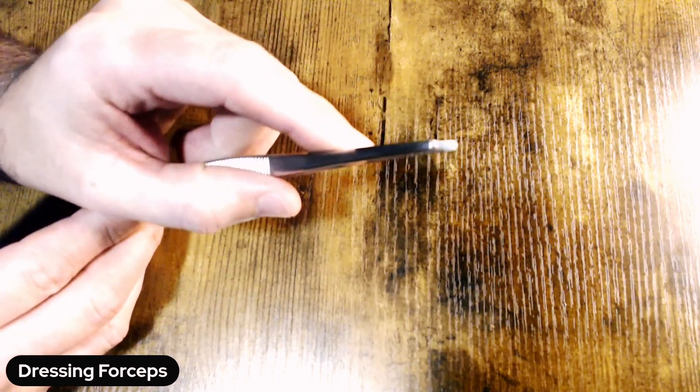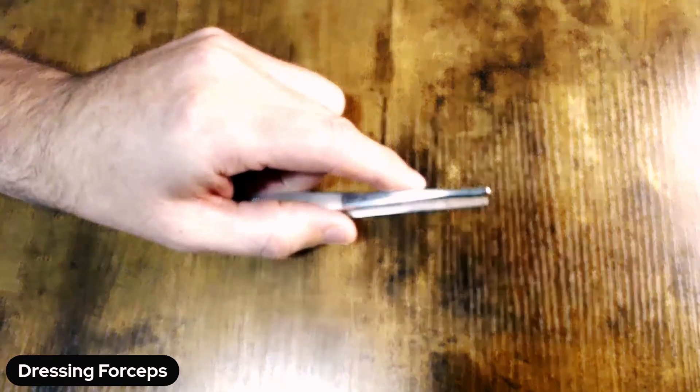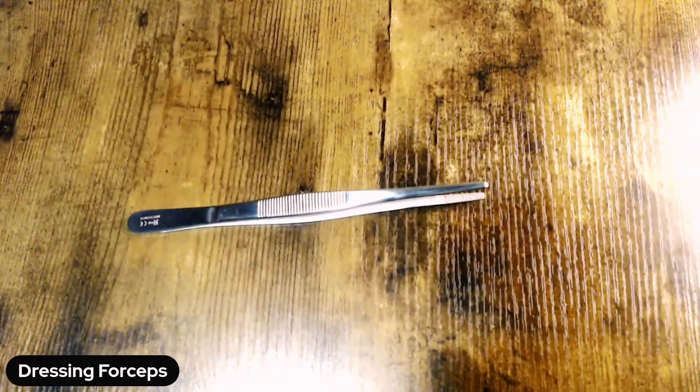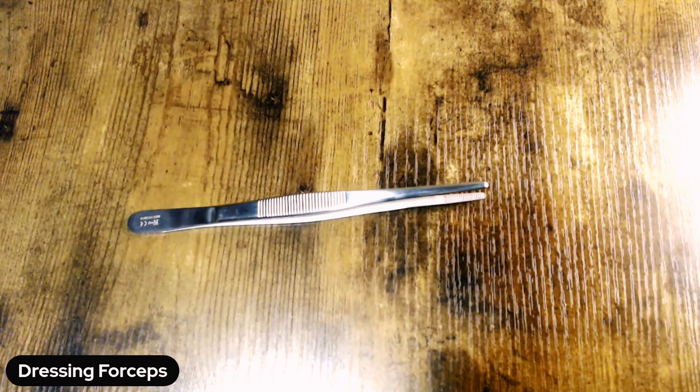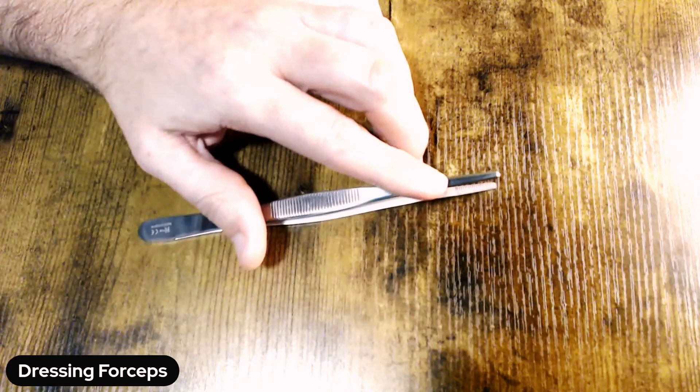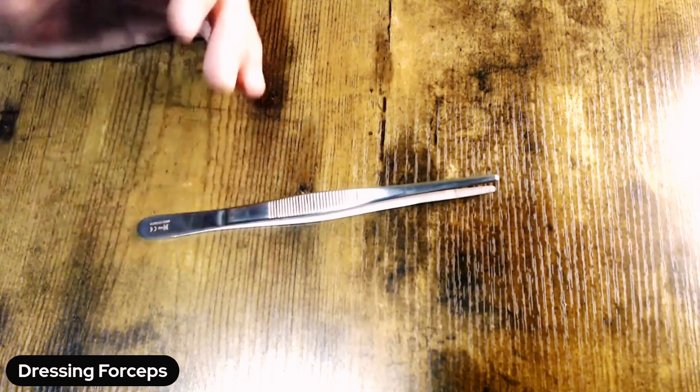And so it's kind of confusing because technicians outside of the industry think, well, if it's smooth, then there must not be anything there—you know, the finish that you have on the top of this forcep and on the handle here.